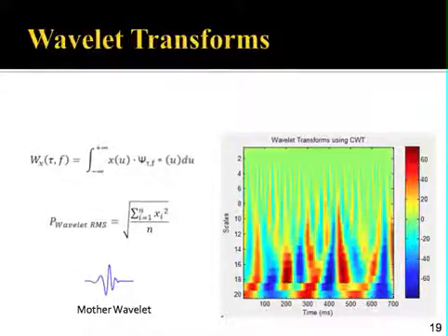So this is a more definitive example of what a wavelet looks like. This is an example of a typical, what is called, mother wavelet function. The mother wavelet function would be like the fundamental frequency in a Fourier series. So it's sort of like the function that hasn't been shifted or scaled. What you're really doing is taking this little function and finding the correlation between this function and your signal. So that's what's indicated here.